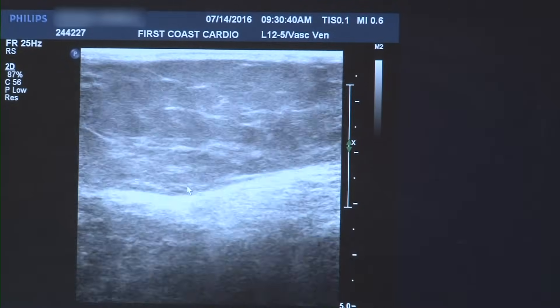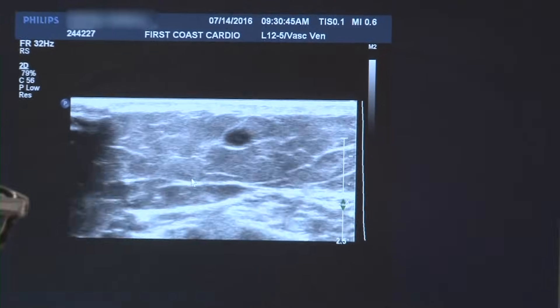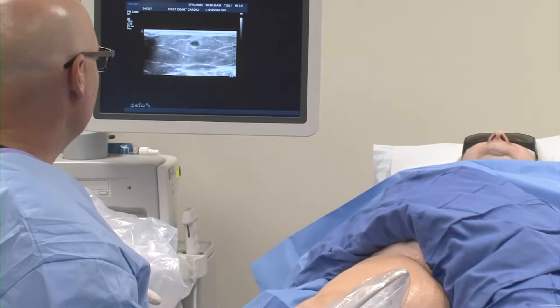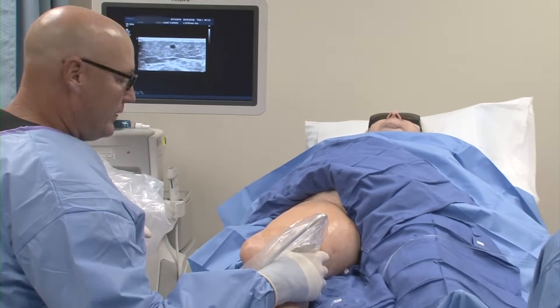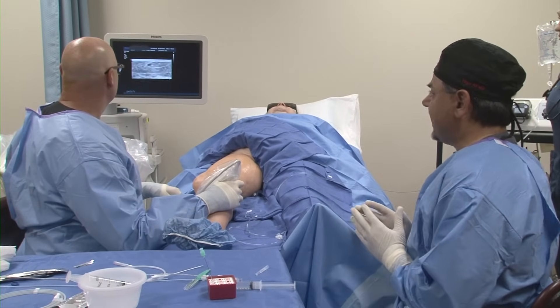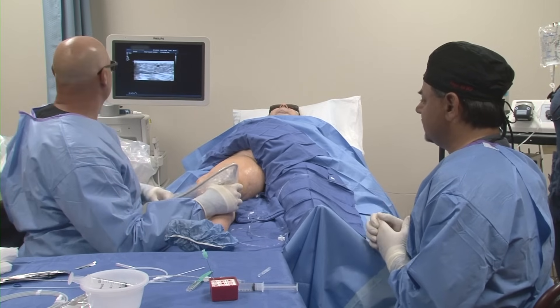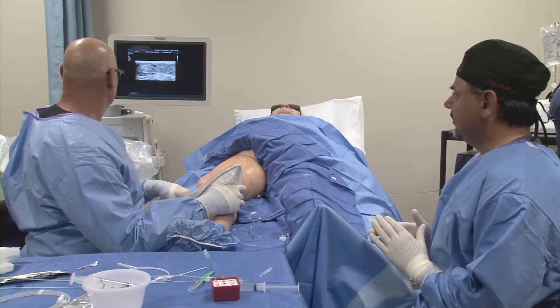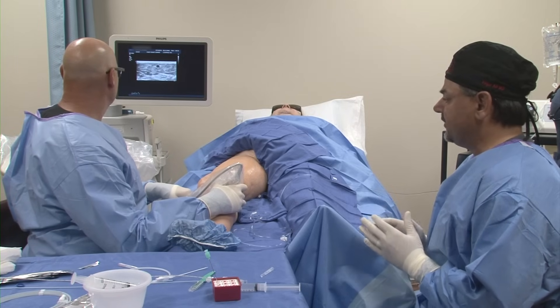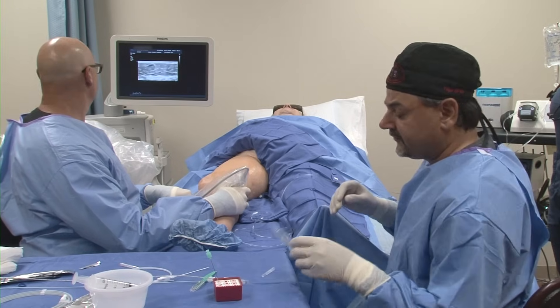The assessment now is whether we want to come below the knee or access a little bit above the knee. In this patient, we have already done an ultrasound and she has had previous ablation as well. Her below-the-knee GSV is partially closed, so we're going to try to access it just above where it recanalizes, and our hope is to go ahead and do a successful ablation of the rest of the vein.